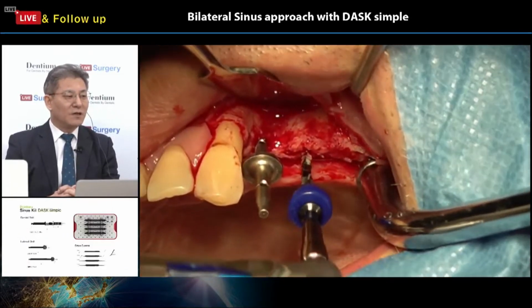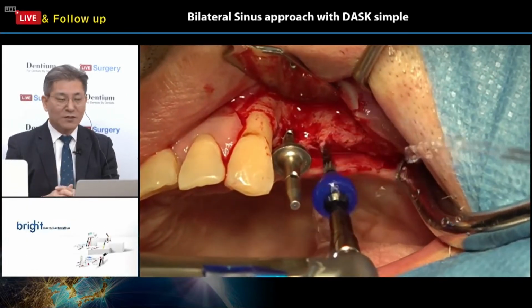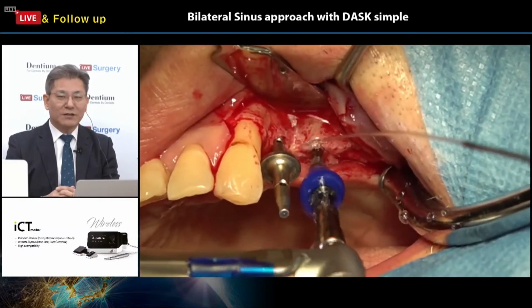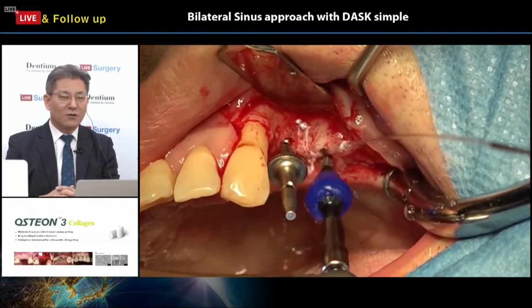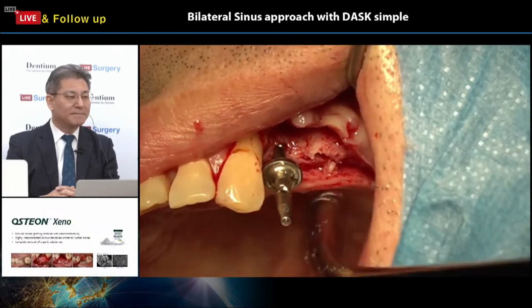For achieving this purpose, he will use the narrow diameter tissue level bright implant system, and the osteon 3 collagen, the collagenized bone.